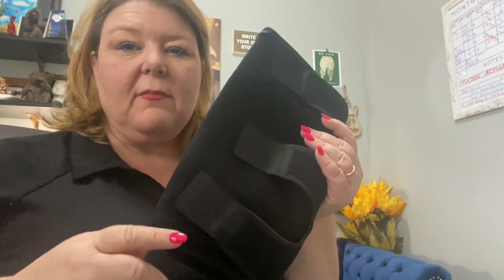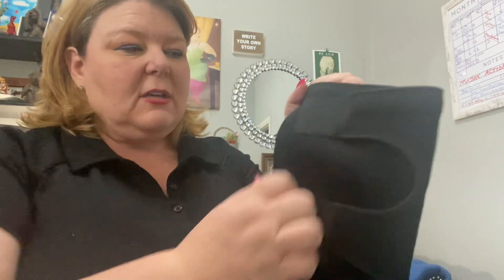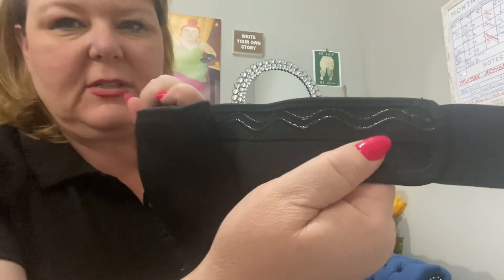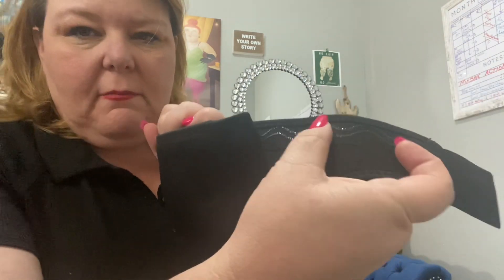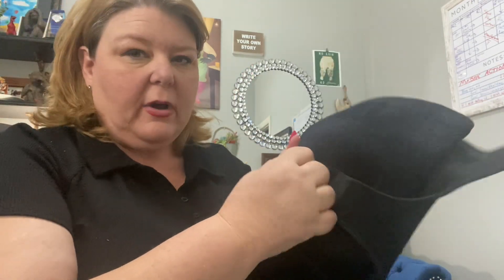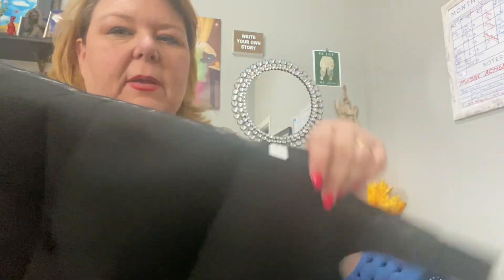This is actually my first time opening it or trying it, so you can see it's got the brand at the top — I'm assuming that's where it goes on my leg. It's got three big pieces of heavy-duty velcro and then this little gooey band thing to keep it from rolling down and sliding. It's designed for people who have a larger leg like me.